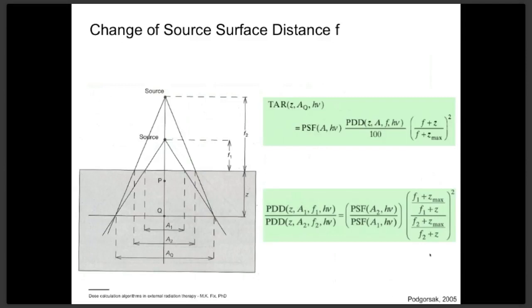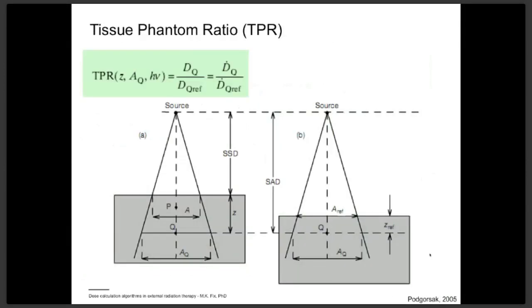Now I have talked a lot about tissue air ratio. If we have an increased energy, then it's going to be very difficult to apply measurements in air. You need to have a charged particle equilibrium, and you need to use build-up caps, and they get rather huge for high beam energies. So what you do is that you change the reference media from air to water.